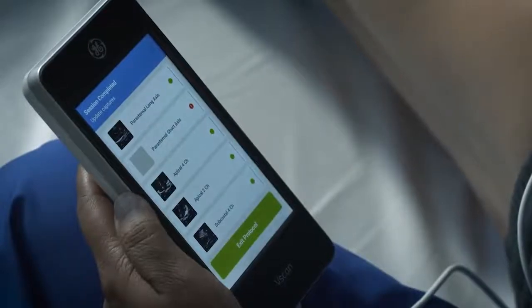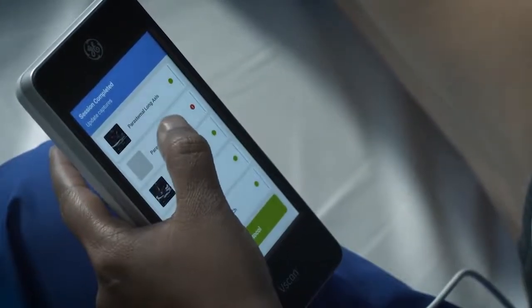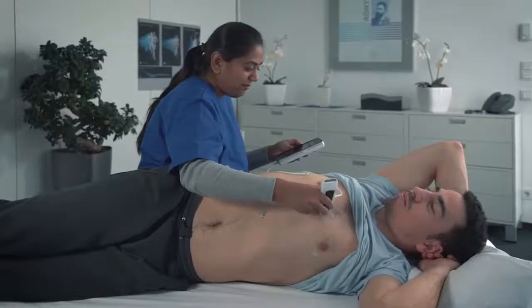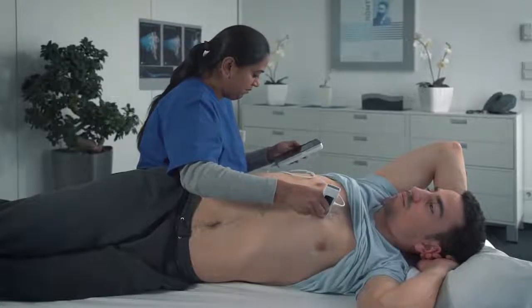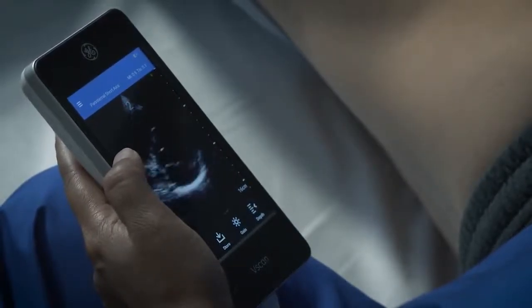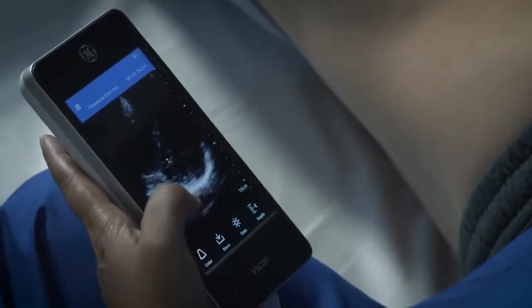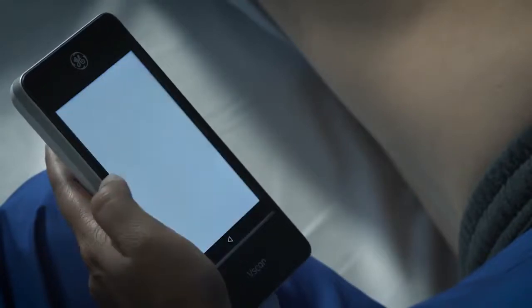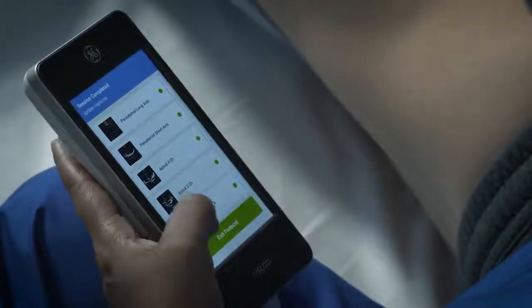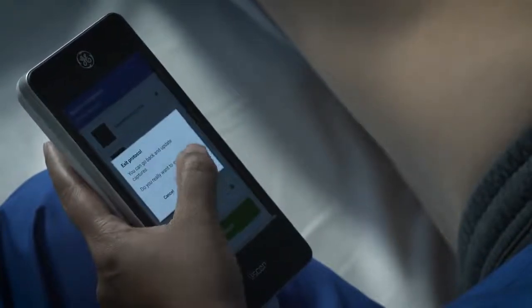You will see all of the steps and what has been completed. You will have the ability to choose a step and reacquire an image. You can swipe left to proceed directly to the session summary after storing an image for an incomplete step. If you have acquired all desired images and are ready to finalize the exam now, you can exit the protocol by tapping Exit Protocol.